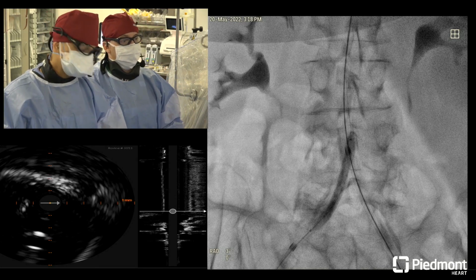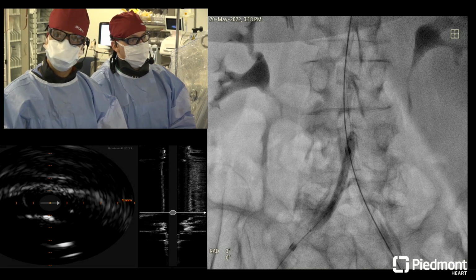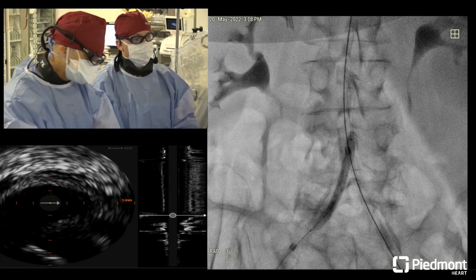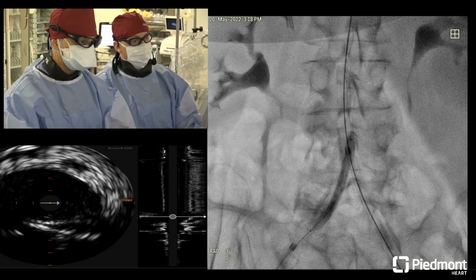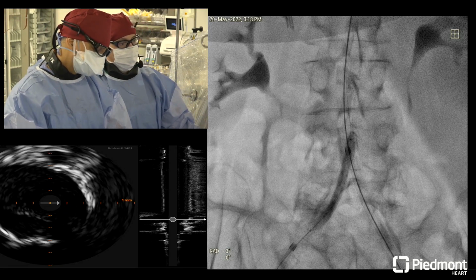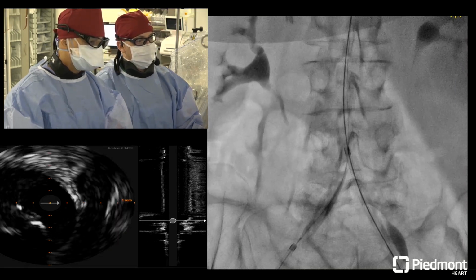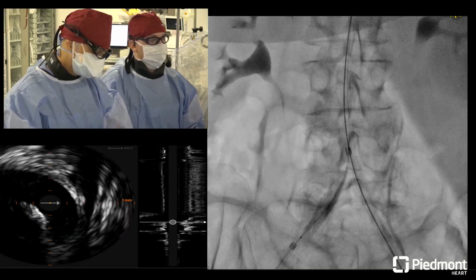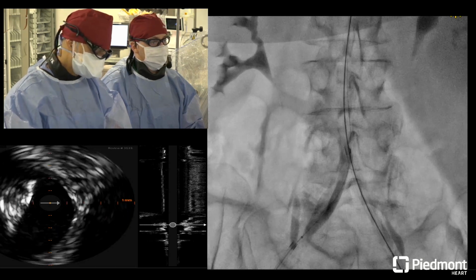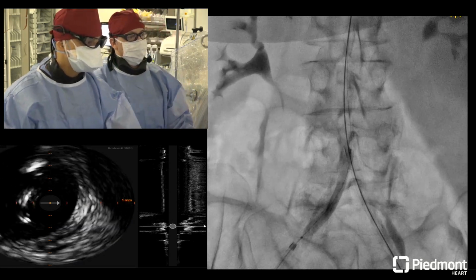Ken, what do you think about the role of IVL here versus just the traditional way of ballooning your subintimal space throughout the common iliac here with heavy calcium and a tiny vessel? It's a horrible case. I don't think we have established that one way or the other. So I don't think it's a bad thing to do. I'm not sure that it's needed.